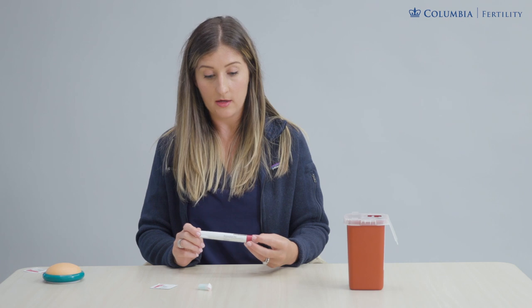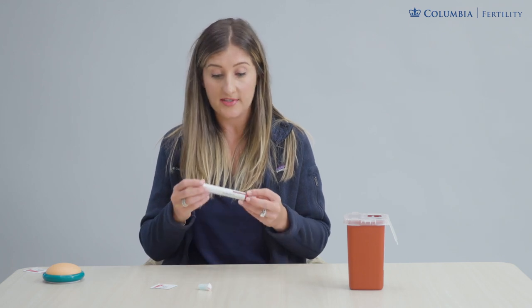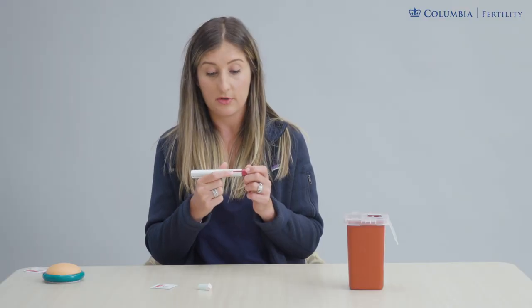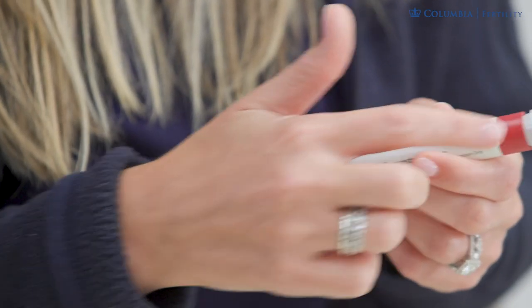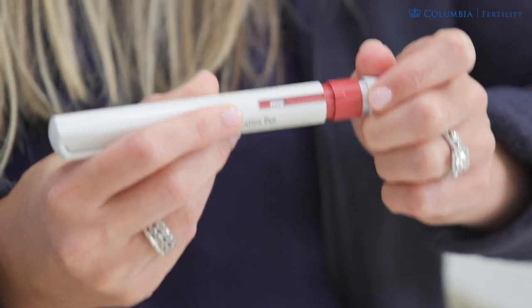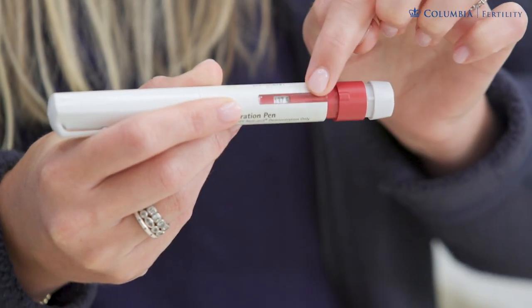To prepare your pen for that evening's dose, you're going to dial up your dose — confirm with your care team how many units you need to dial up. When you take the pen out of the box, check that the number dial is set to zero. The end of this pen is a dial, so you'll be twisting it up to your desired dose. If you end up twisting too far, you can back up and dial it back a few clicks, carefully dialing so that your dose is displayed in the window.